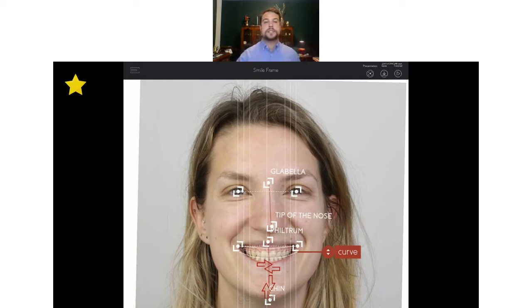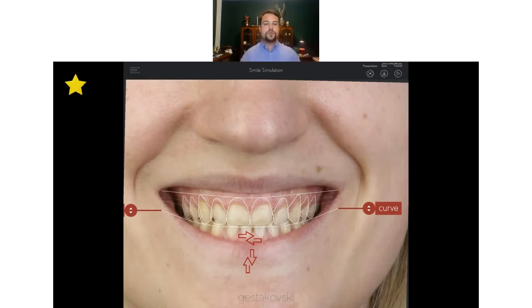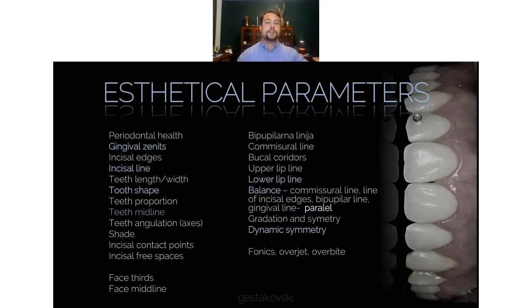I'm doing the simplest thing, but you can also design in the software itself. It is good for the communication with the patients. Of course, nowadays we're trying to go more and more digital. All these parts you need to pay attention to when analyzing your patient.